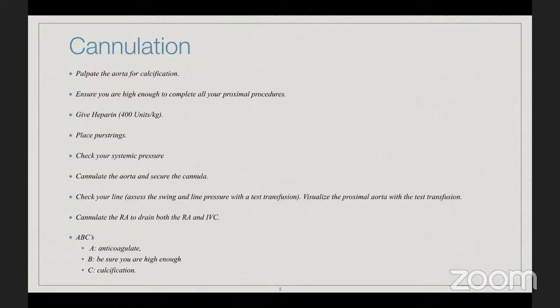Some surgeons I work with communicate with the perfusionist all the time. At this point of the surgery, they direct the perfusionist in doing this test. After the perfusionist connects his line and removes the clamp, the surgeon will say, what's your pressure? And after he knows the pressure, he will ask him to give the test volume. I see. Thank you. Thank you, Dr. Michael.